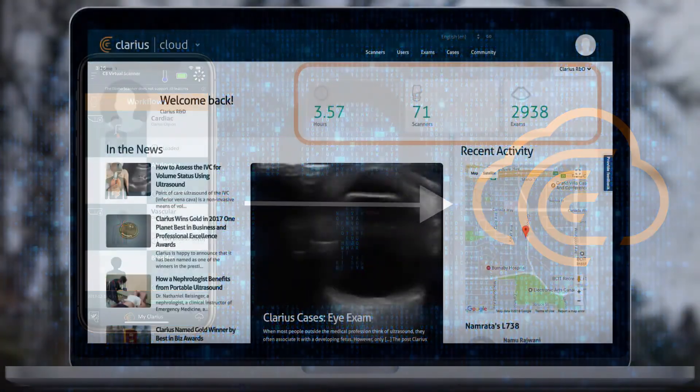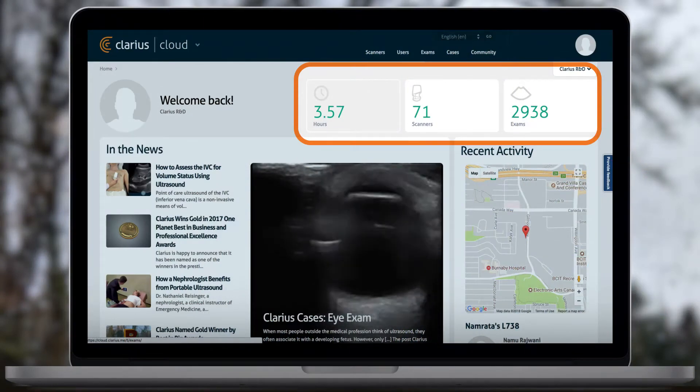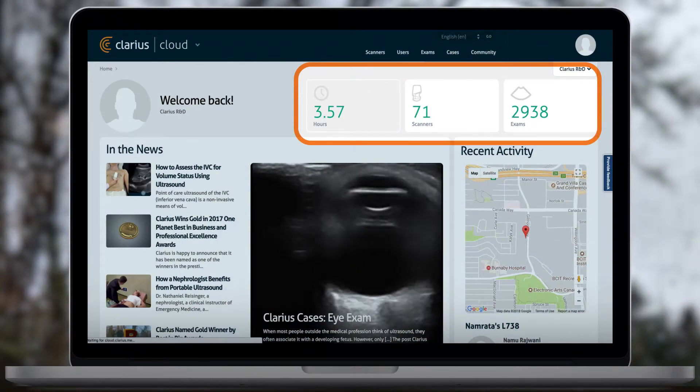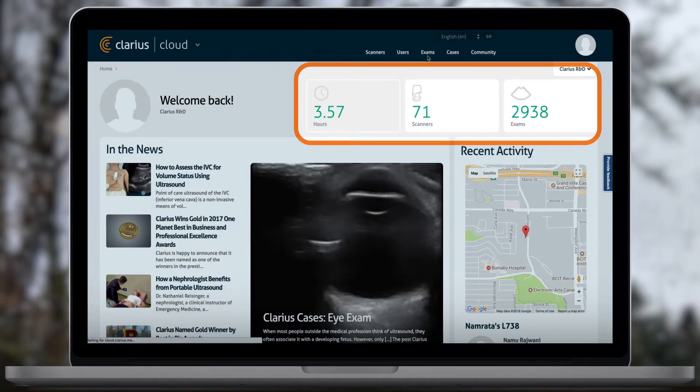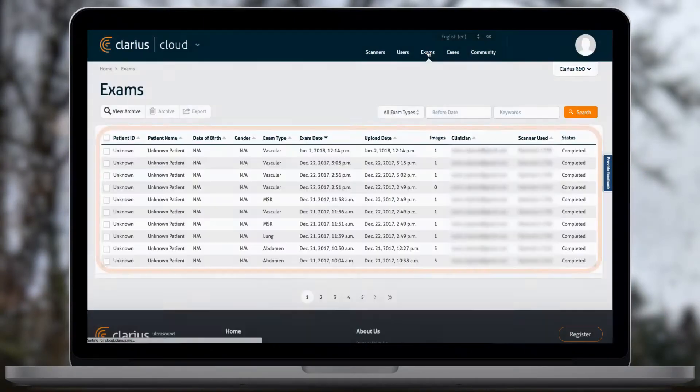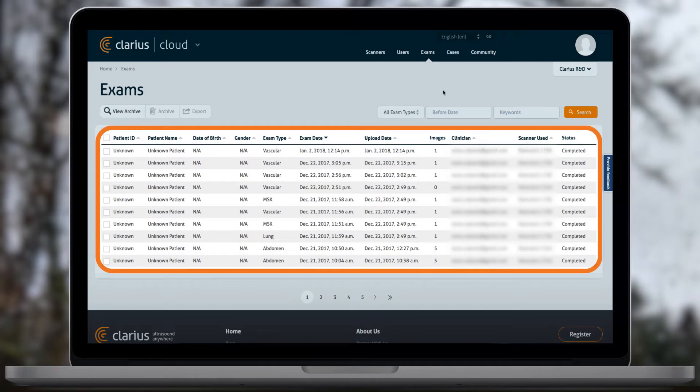Institution administrators have access to all data from that institution, while clinicians only have access to patient information and their exams.